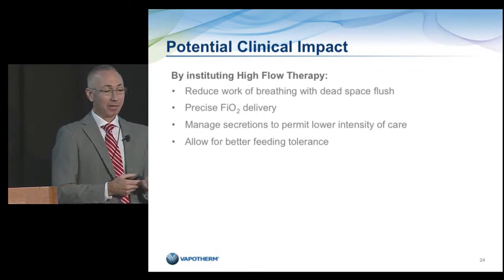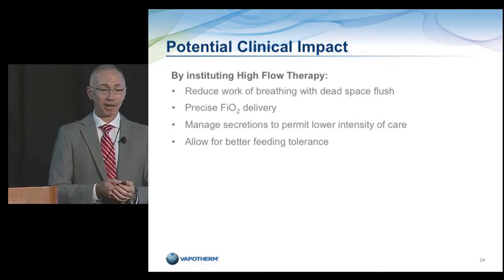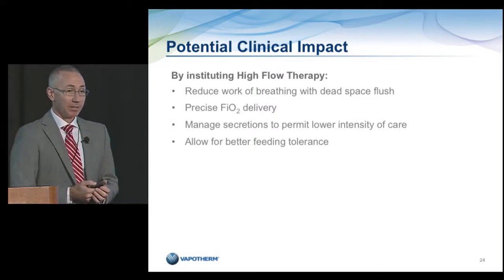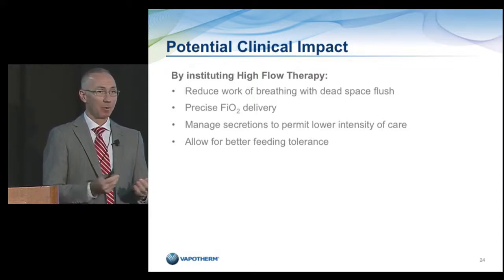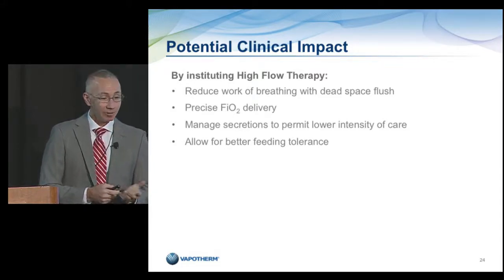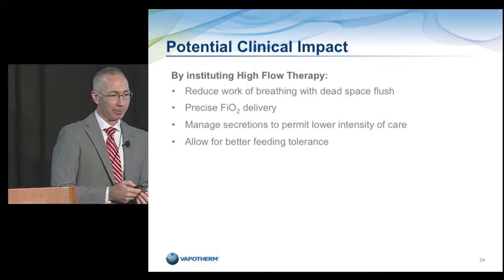That can be very easily accomplished with a simple nasal cannula connected to a high-flow device. Additionally, unlike the positive pressure CPAP or BiPAP devices, high-flow cannula allows one to feed the patient through high-flow therapy.